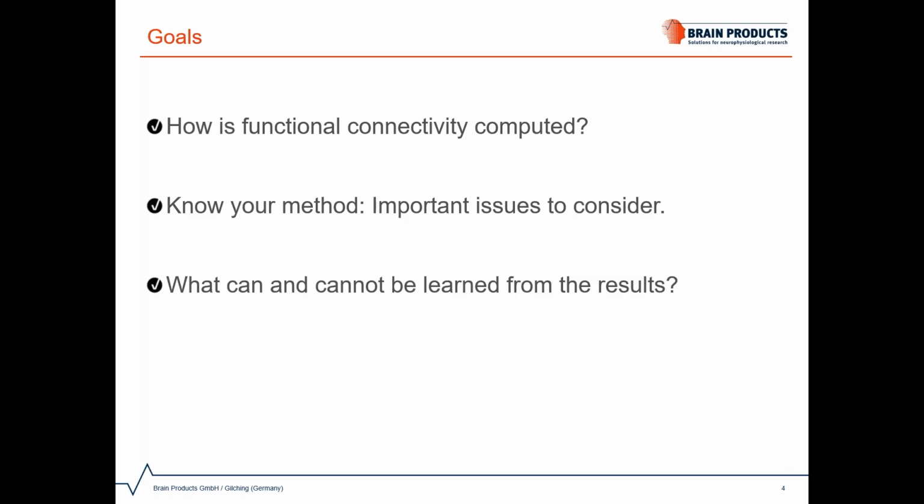Therefore, two of my main goals for this webinar are to raise awareness about the issues that are to be considered before and during analysis. But I would also like to provide guidelines to what can and cannot be learned from the results.